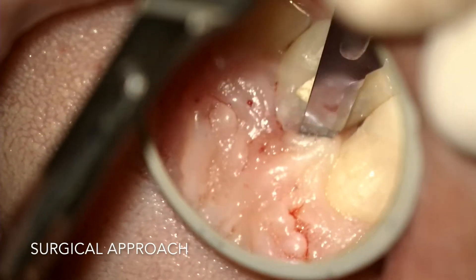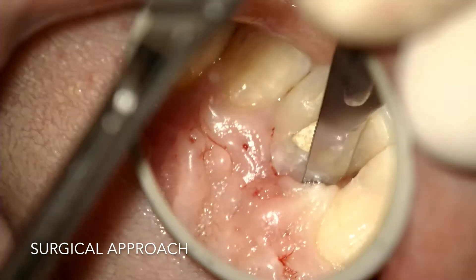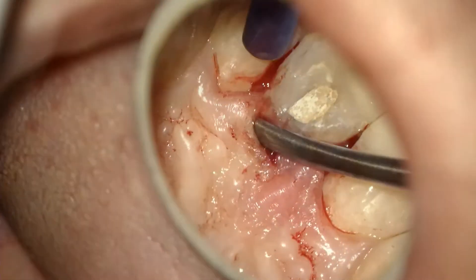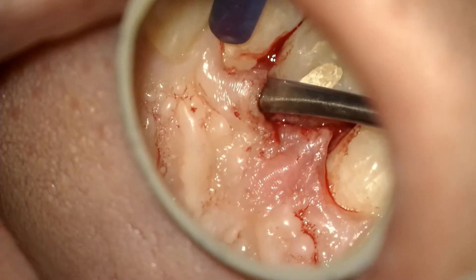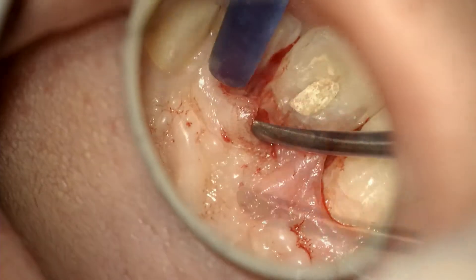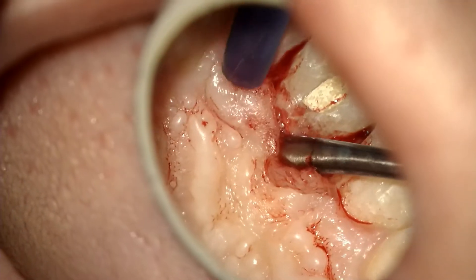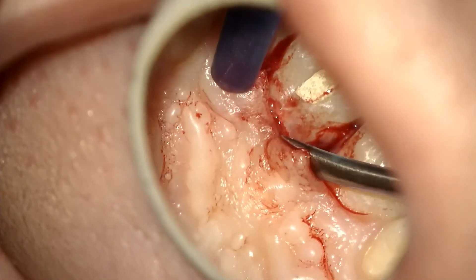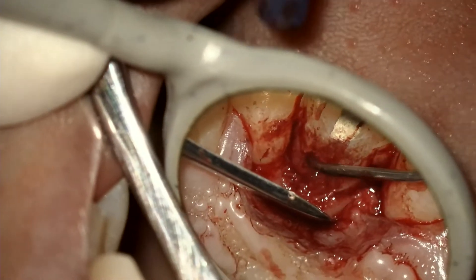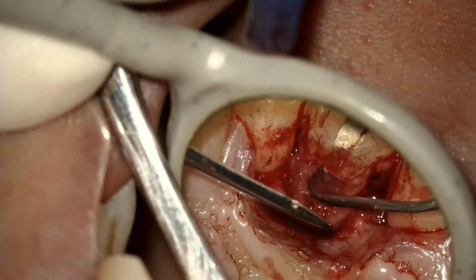We performed a surgical approach, raising a palatal flap and cleaning all the resorbed tissues.